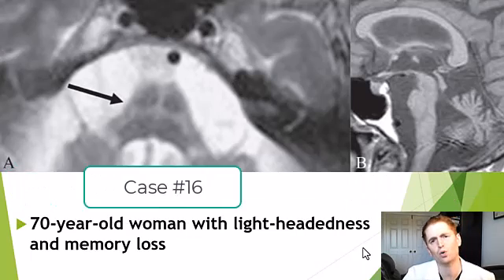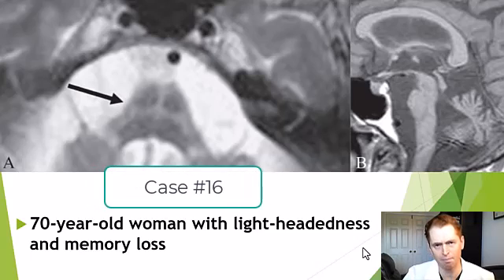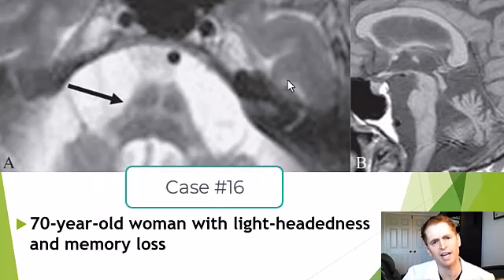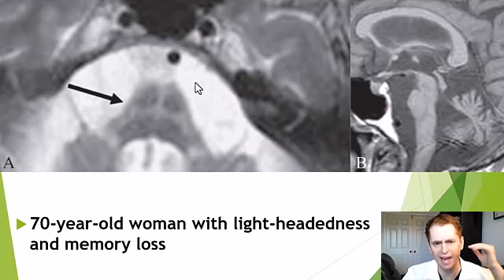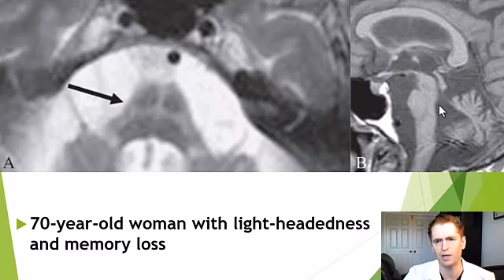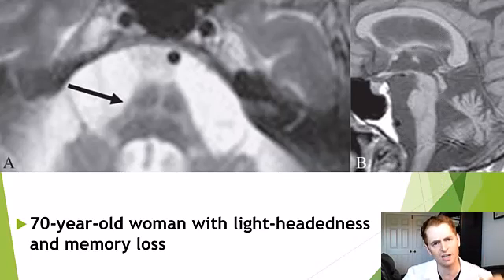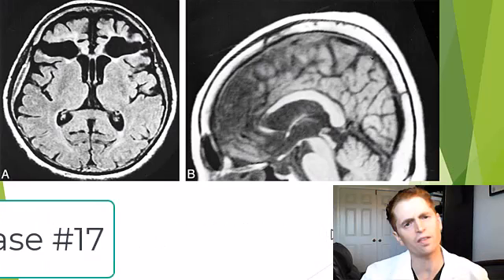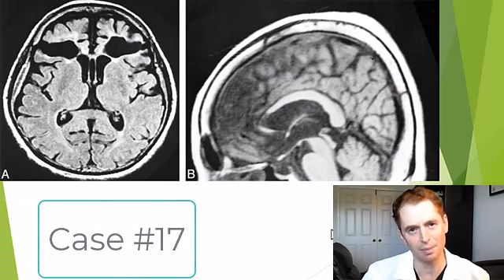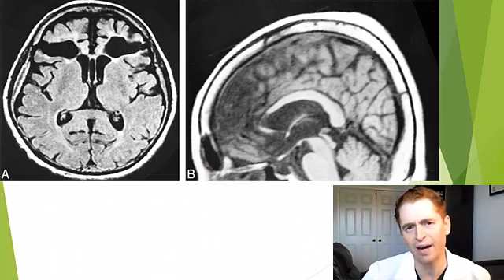A 70-year-old woman with lightheadedness and memory loss. On the left, a zoomed-in axial MRI slice focused on the pons; on the right, a zoomed-in sagittal MRI. The more distinctive finding is shown by the arrow on the left. And now the case that stumps neurology residents every single time: an 80-year-old man with a history of psychiatric illness.